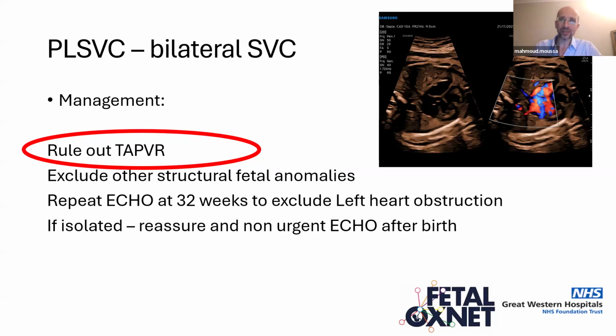And there is a very useful tip as well, which actually can be detected in even a 2D scan, which is the distance between the aorta and the heart, the area between the heart. The area between the heart has been studied recently, and there is a lot of publication on this. If you've got a big distance between the aorta and the back of the heart, this makes you start to suspect that there is an abnormal venous return, or abnormal return into the left atrium.